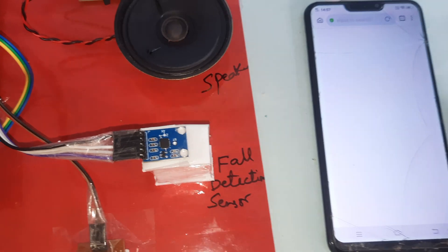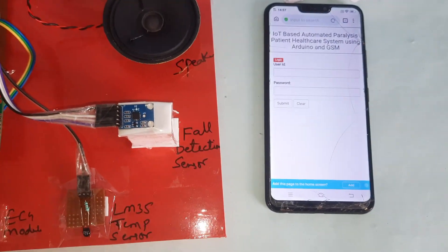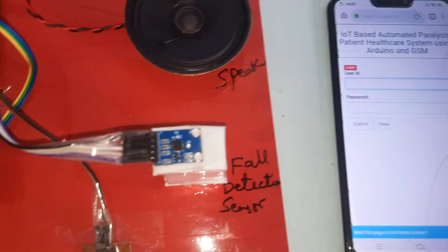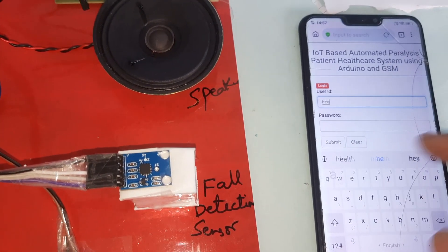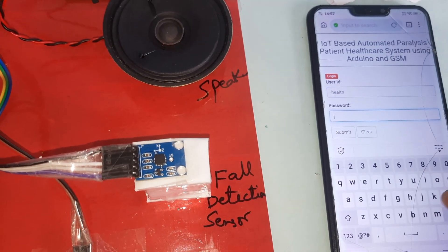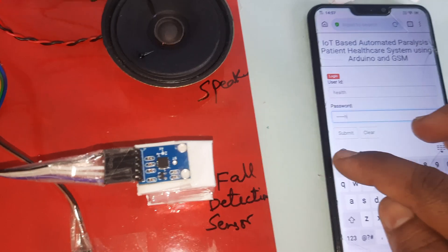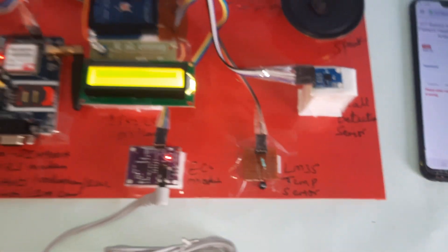Going to the main web page — there is the APR33A3 voice recording and playback IC. Here are the login details for the login webpage. Username: health, password: health123. Submit. Now let's start with the power supply.